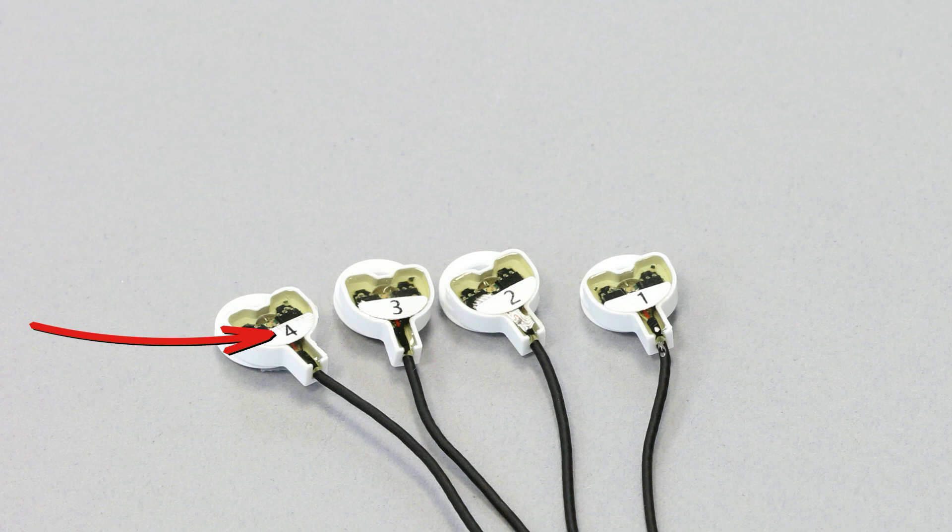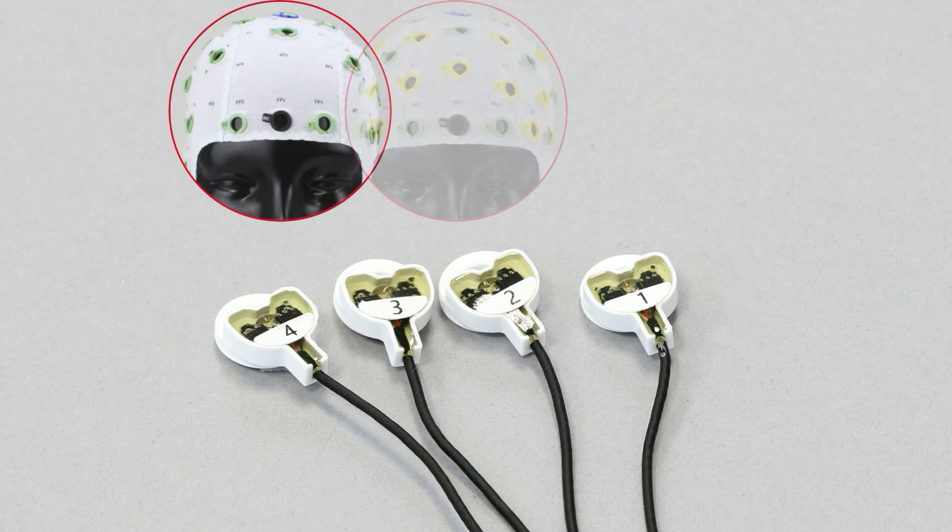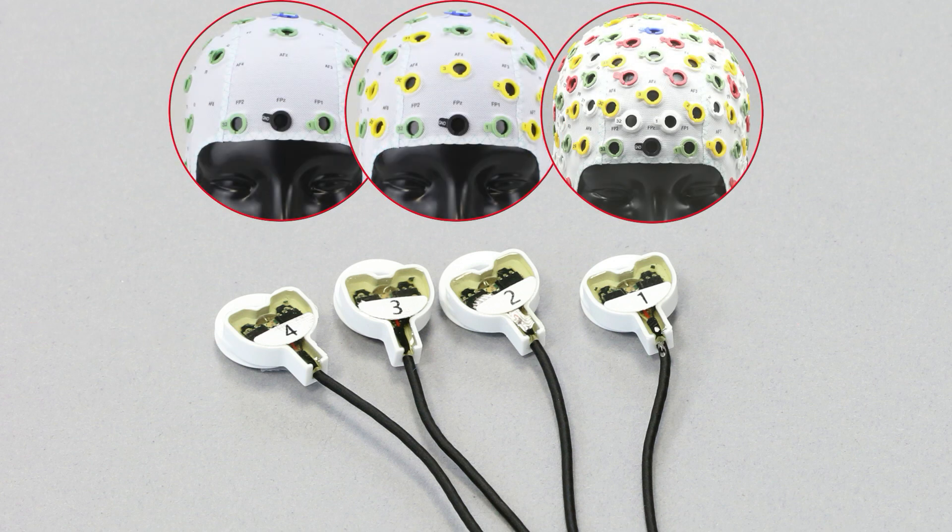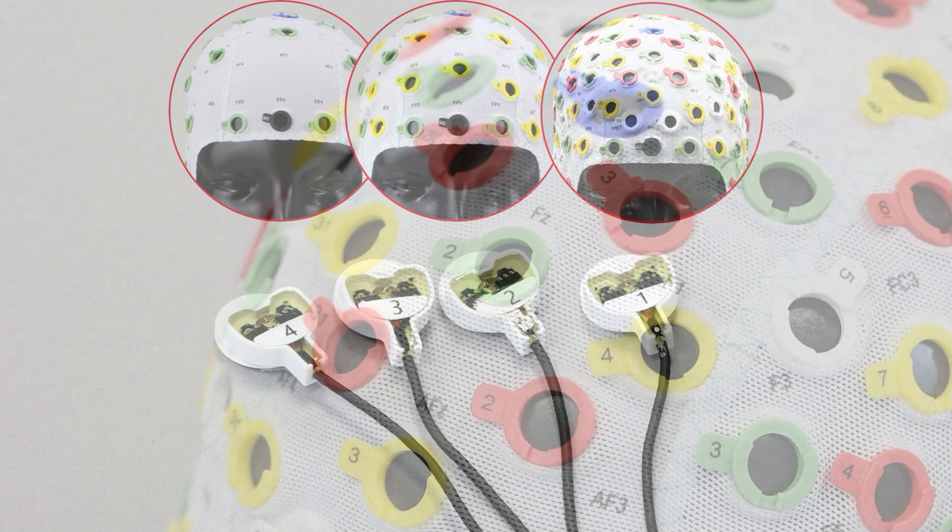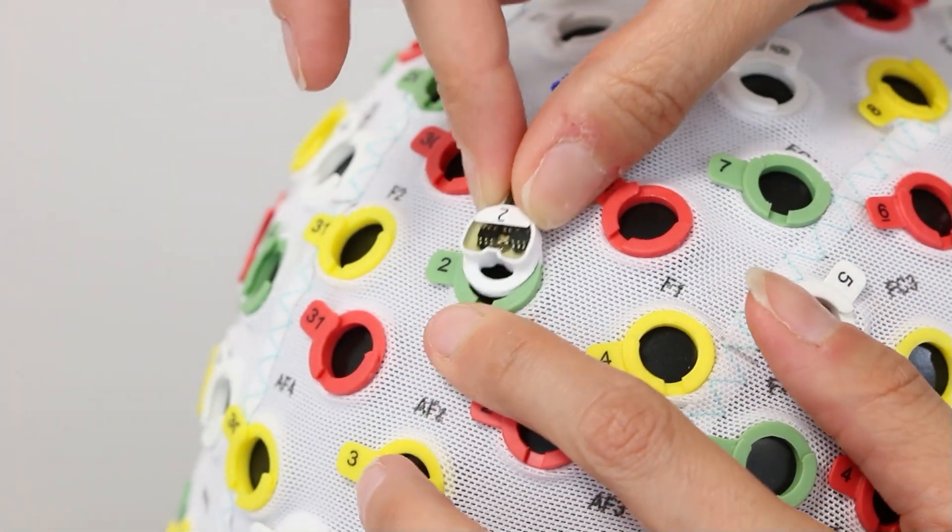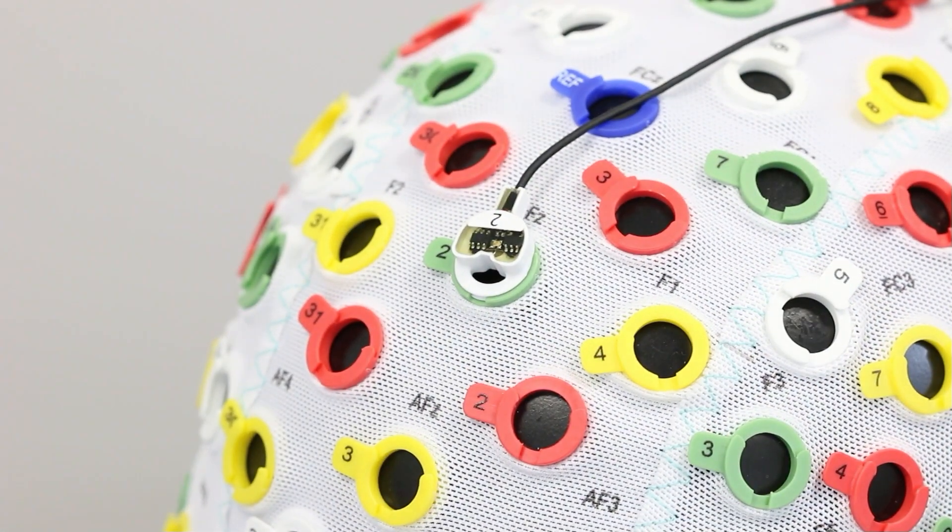ActiCap slim electrode bundles can therefore be moved in between ActiCap snap caps of different channel counts, sizes and layouts, by inserting the electrodes into dedicated holders. These holders are fixed within the cap fabric and also labeled with numbers from 1 to 32. This design eliminates any guesswork when inserting the electrodes into the respective holders.